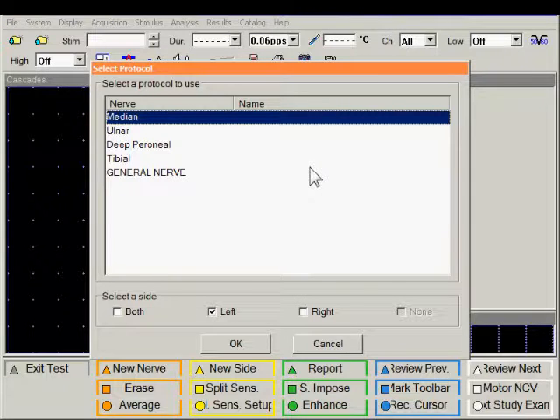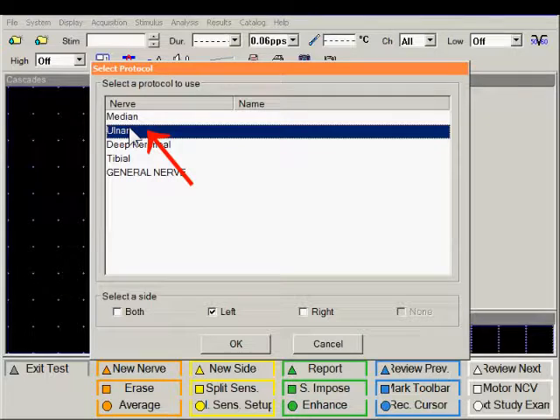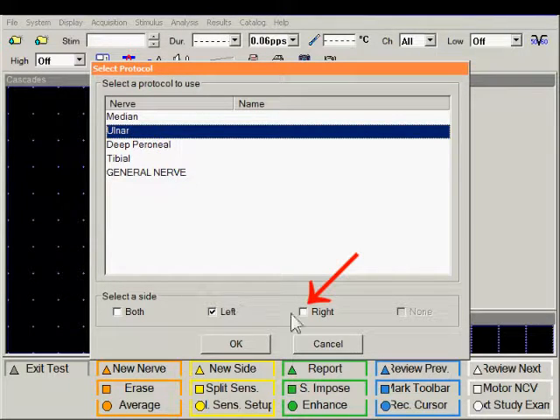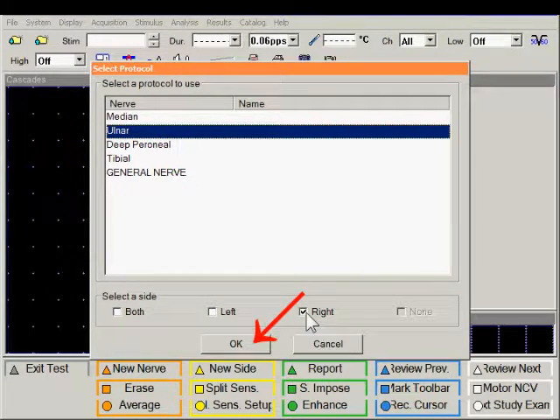A selection of nerves are displayed. In this example, we're going to use Ulnar, and we're going to choose our side and then simply click OK.